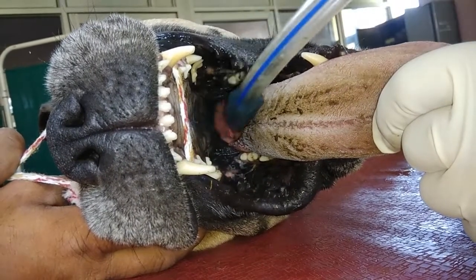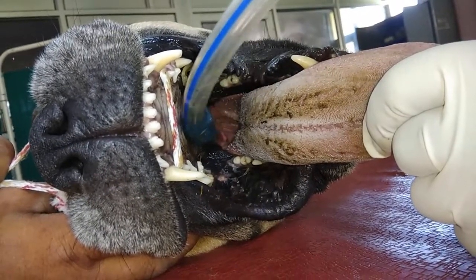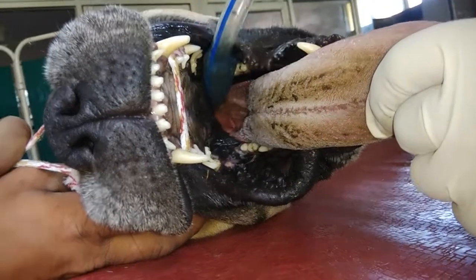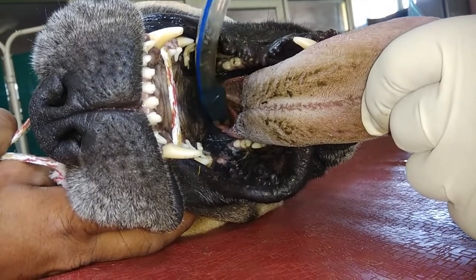The convexity of the endotracheal tube should be towards the hard palate and soft palate. As we advance, you can see here — this is the epiglottis.